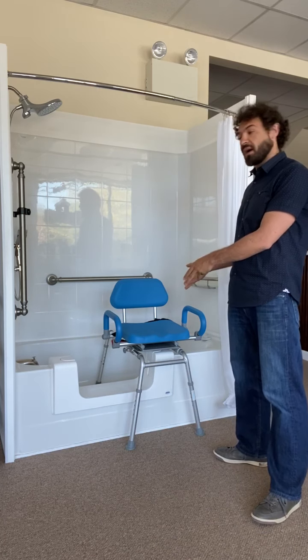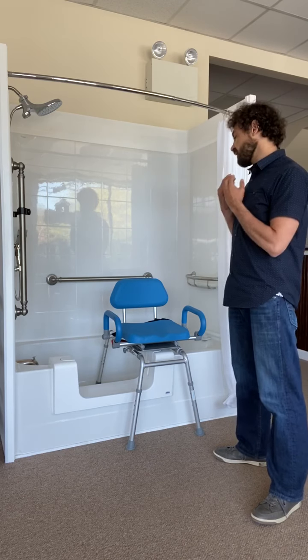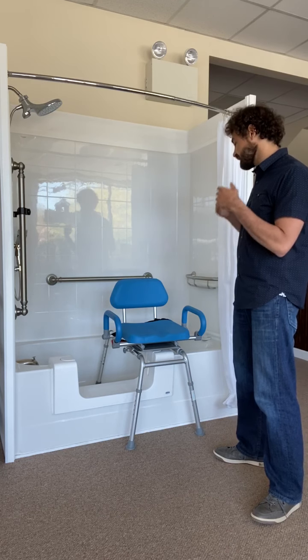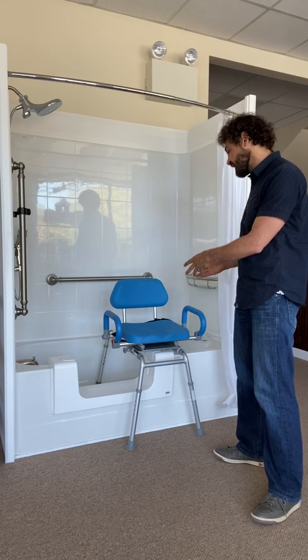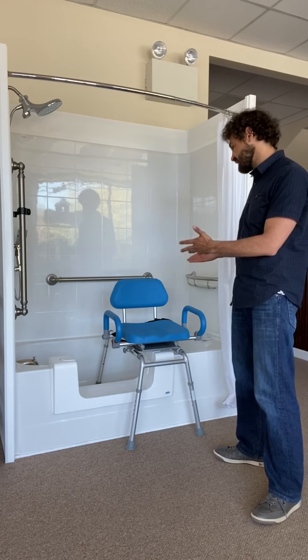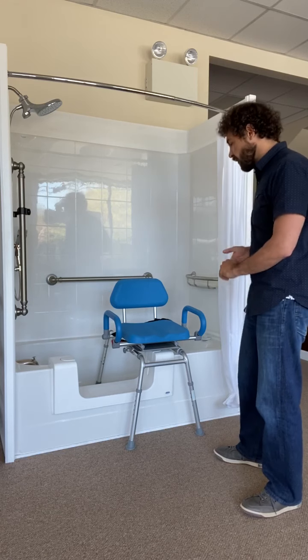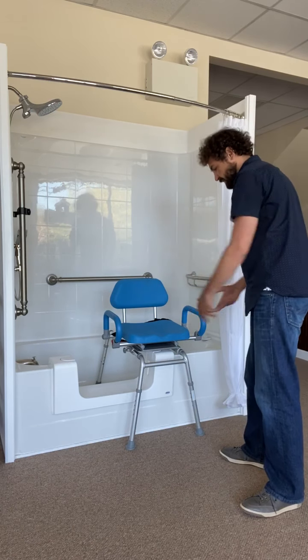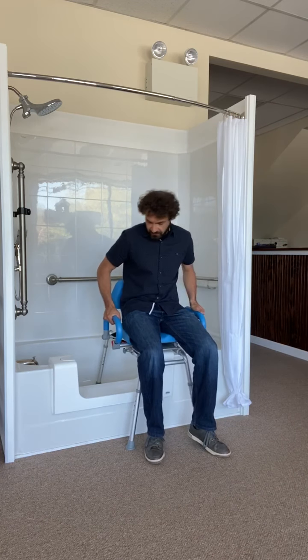What this upgraded model does is going to help with the swiveling and with the sliding. Some individuals will benefit from this because it gives them a little extra assistance and some other safety features. So as we approach this bench, you're going to see that it's squared up to the entrance here, and we're going to come sit down like this.